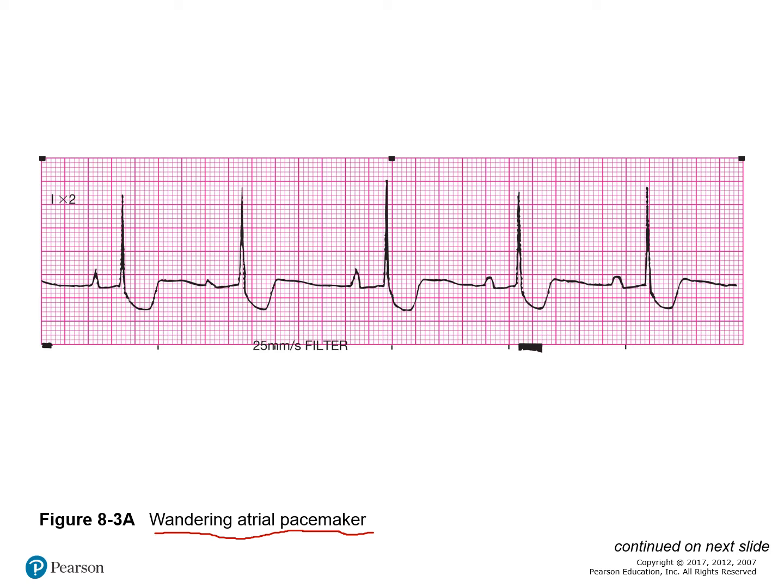And the next thing we have to figure out is regularity, right? So we're going to figure out regularity. So we're going to go from R to R to R and to R.